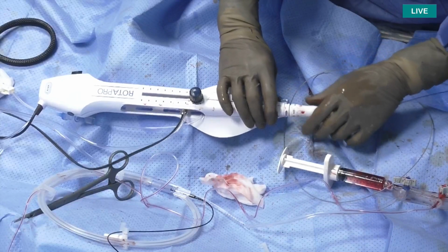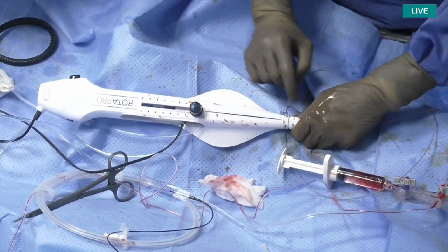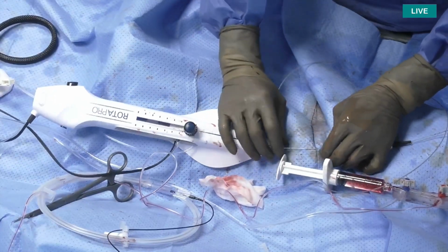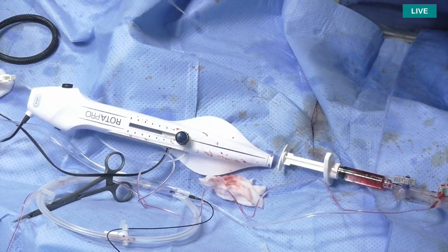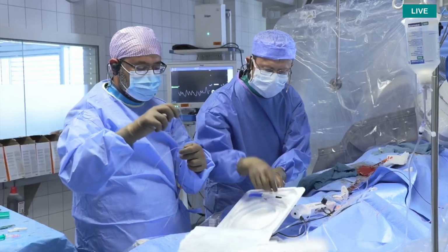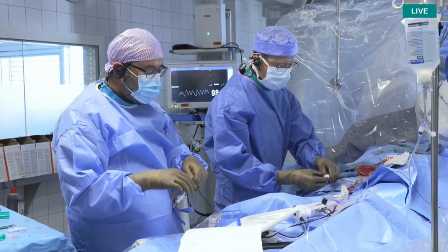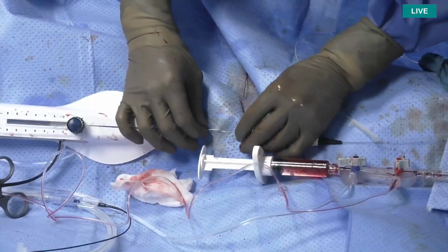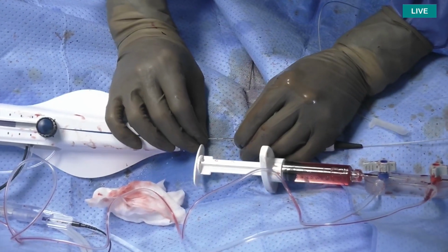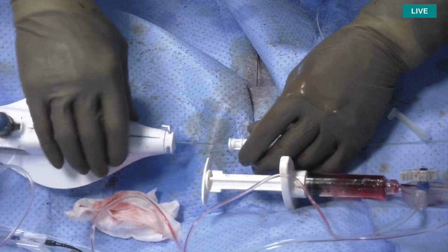So it starts, of course, by disengaging the first burr, the 1.5. It's quite easy. You have to push the button and pull it and remove the old one. Okay. Now you need the new one with another size. And then the most important step is to get this really engaged. It's a bayonet connection, so it needs good eyes.